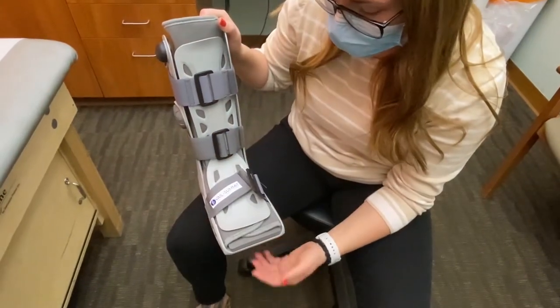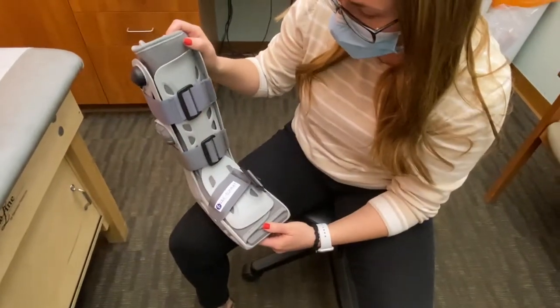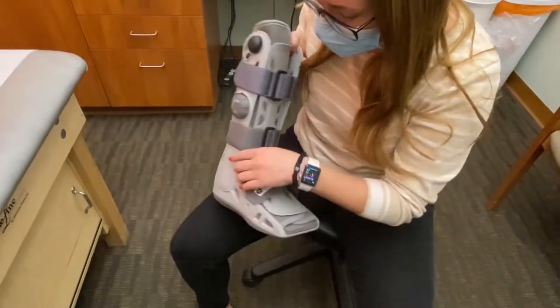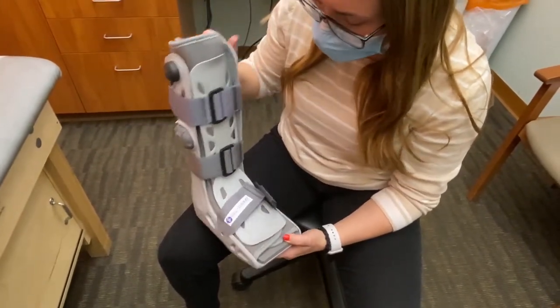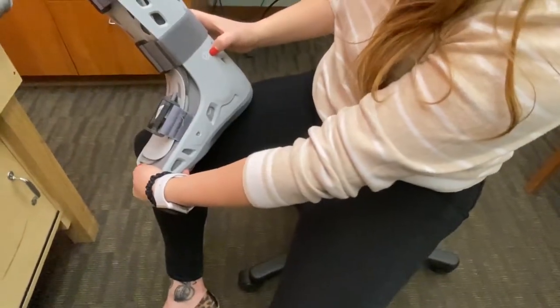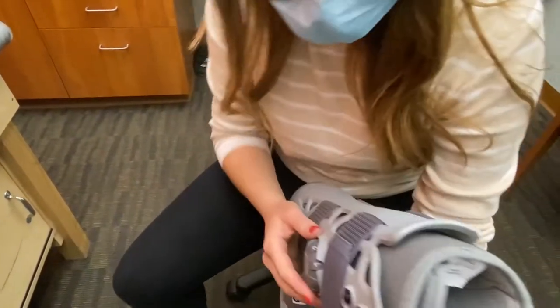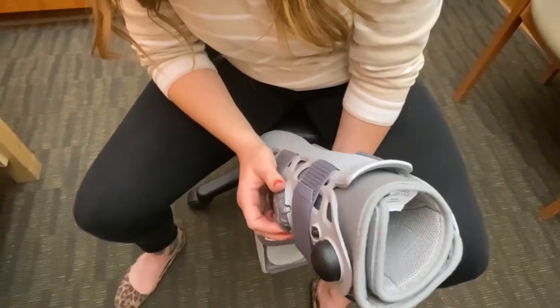This is our Aircast rebound walker. After you get everything strapped in, you'll notice that this device has some stickers on the side. It is designed with two air chambers, typically labeled with stickers one and two, and they are also associated with this dial here — one, two, and then a safety lock.